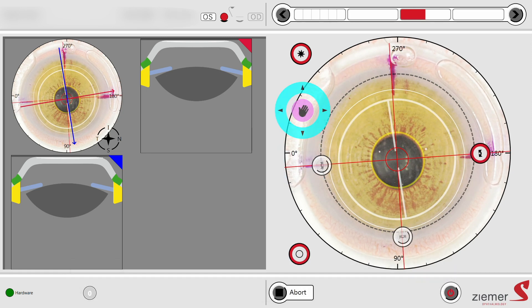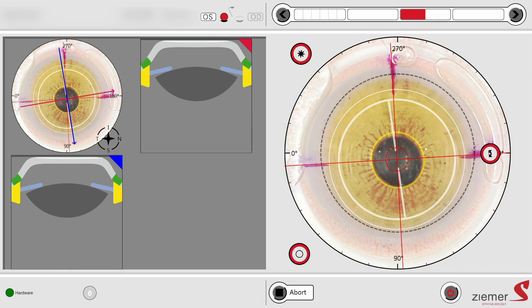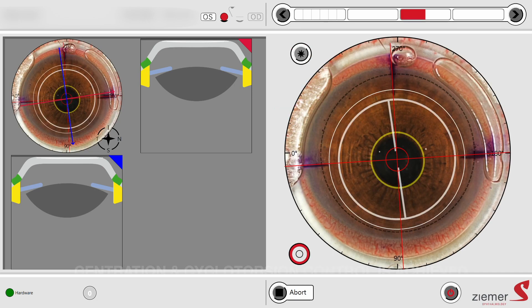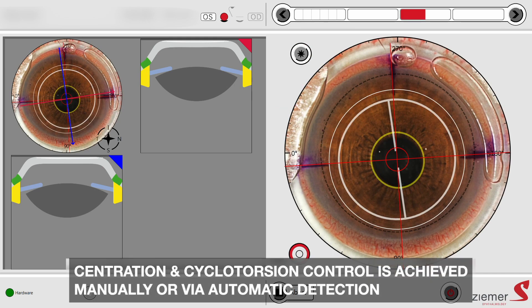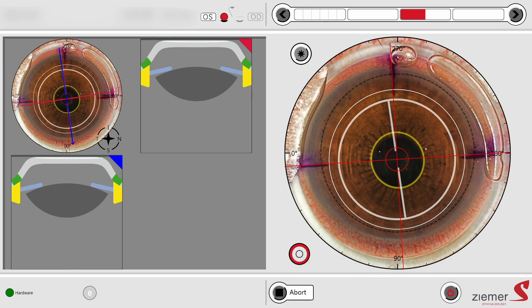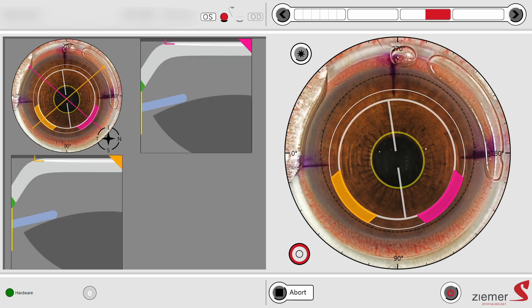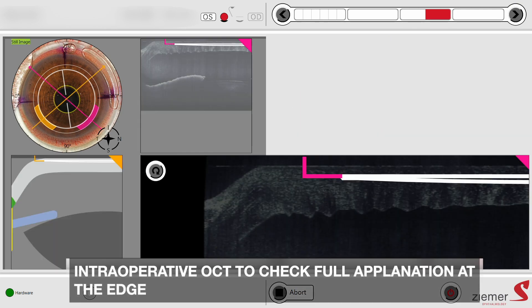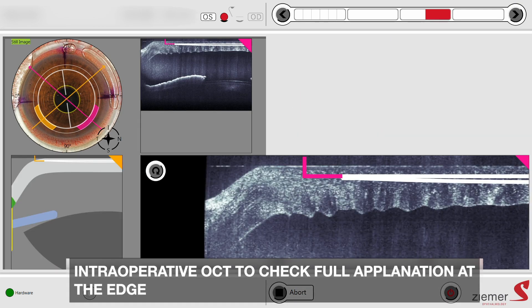This step will soon be automated by matching the image of the eye from the Galilei tomographer. In case of doubt, an intraoperative OCT can be performed to check that the optical zone and incision edges are within the applanation area.